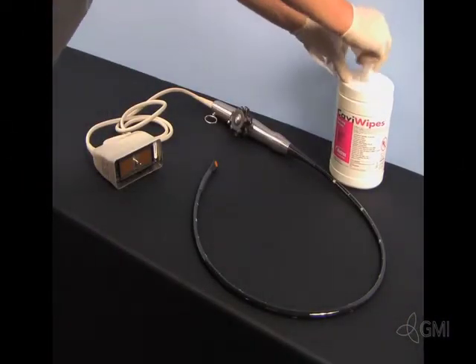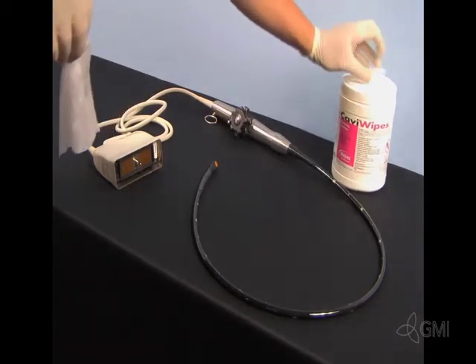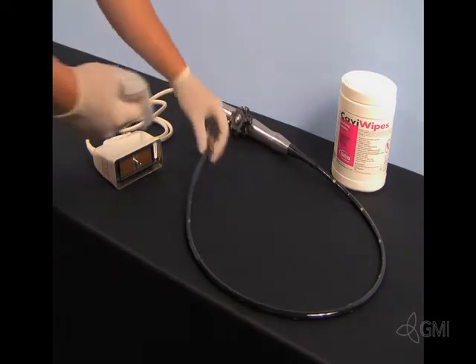The first step in any inspection should be disinfection. All surfaces of the transducer should be cleaned before handling. Start at the tip and work back to the connector.